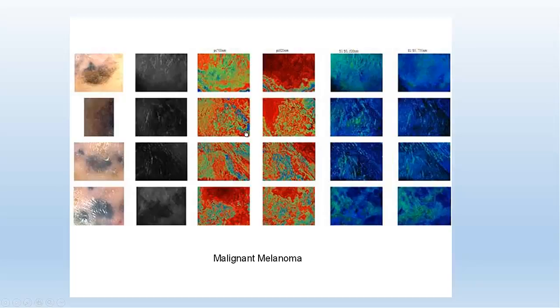So what we see with our bare eyes is not necessarily what happened underneath the skin. Now, if underneath distortion can deteriorate to cancer, it is very important to understand that it actually exists.